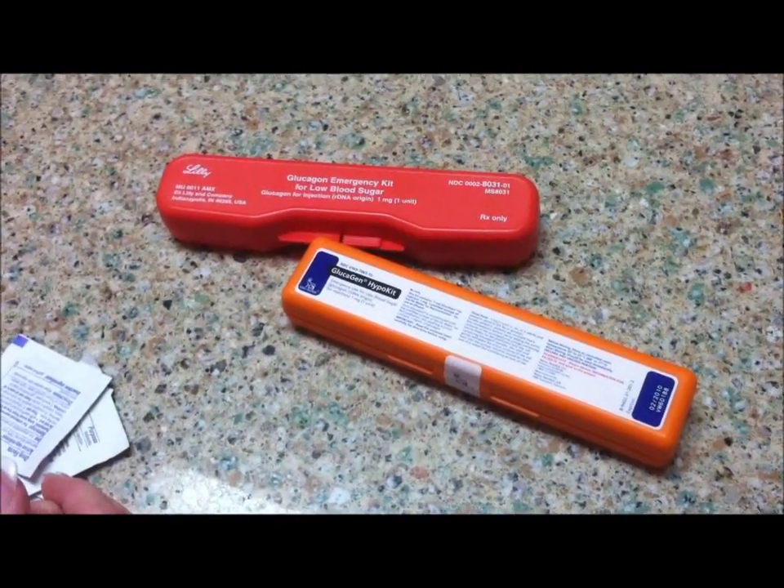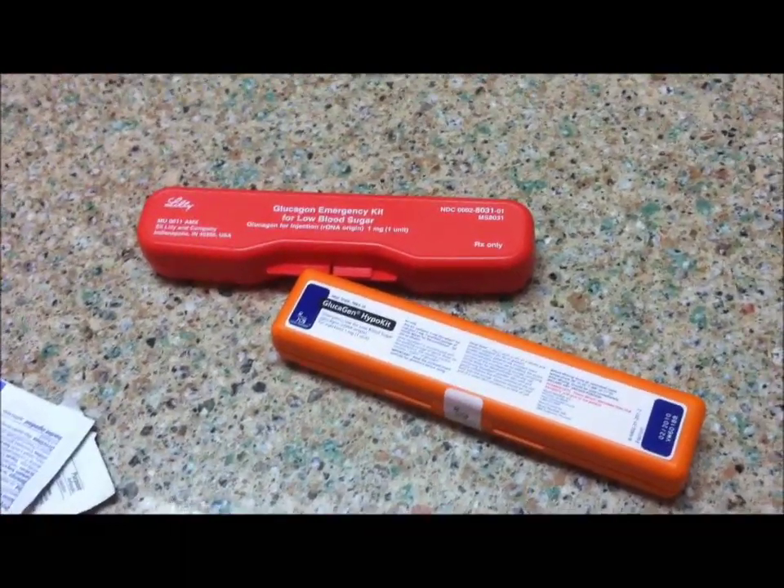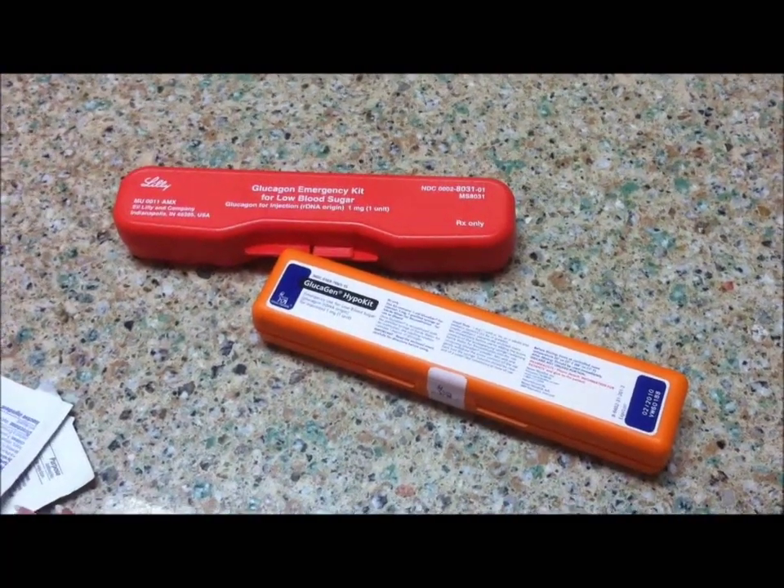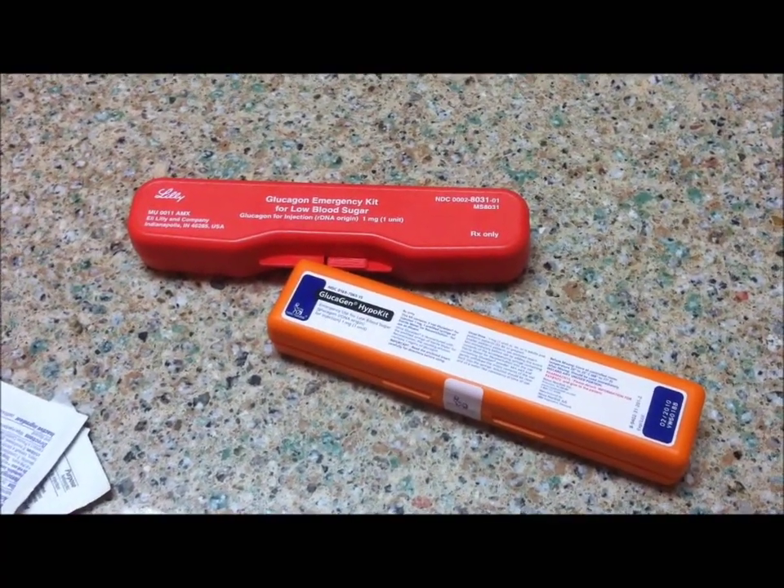This is a video demonstration on the use of glucagon, which is used in cases of severe hypoglycemia for patients with diabetes who are usually insulin treated.